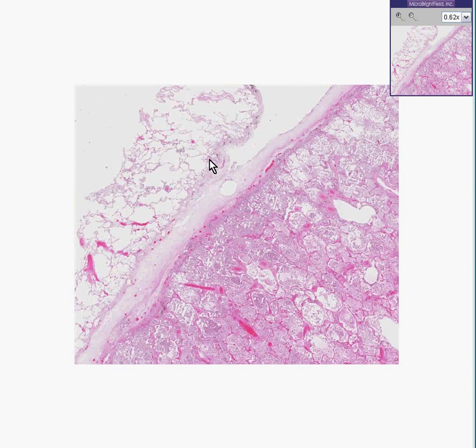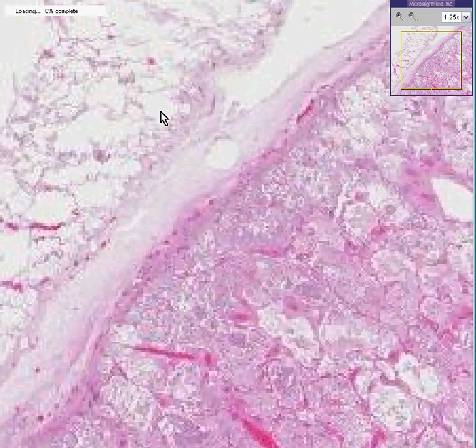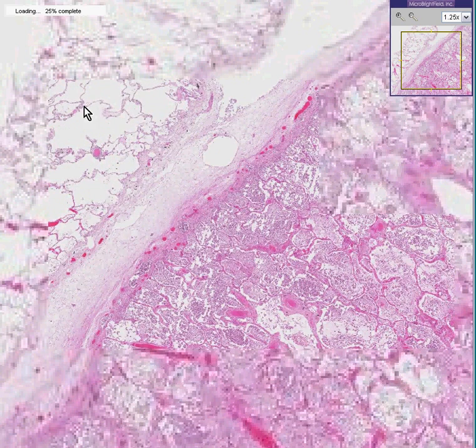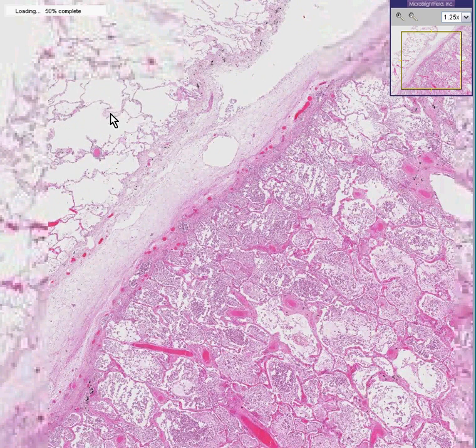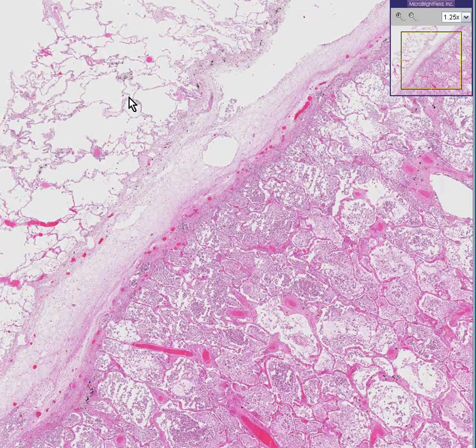Even at this low, low, low power, we can recognize this instantly as lung — normal lung up in the northwest. And we can see nice thin septae, nice alveoli filled with air, and then we could see a pleural surface here.